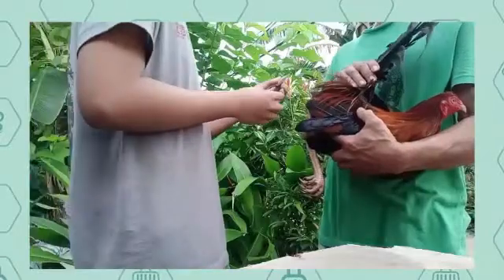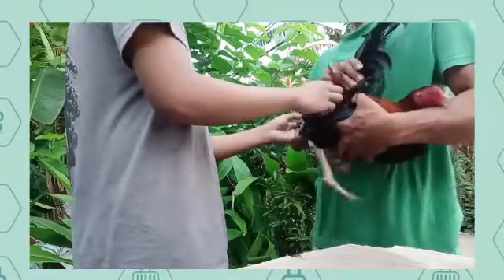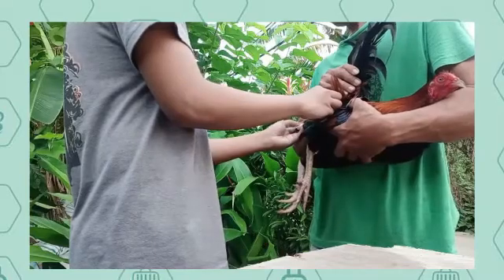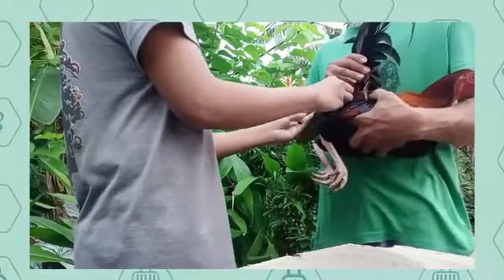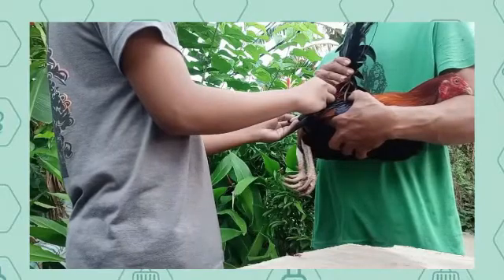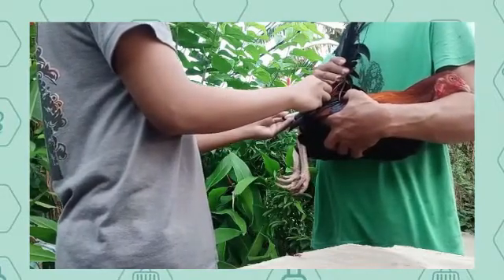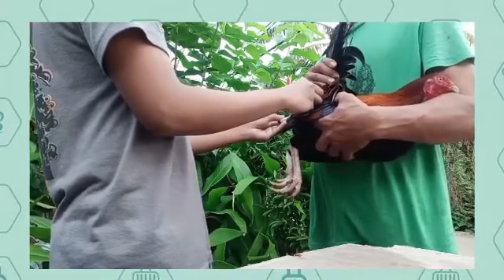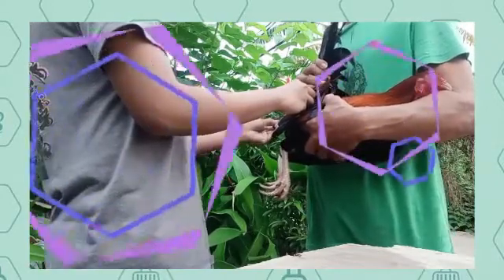Today we're going to check the temperature of a chicken. In checking the temperature of a chicken, we must need a thermometer. First, we must hold the animal without causing excitement. Next, we must take the thermometer without touching its bulb. We can determine the body temperature of this chicken by inserting the thermometer into the rectum. Wait for a little longer, or to be exact, hold it for 1 minute and 30 seconds in the position.